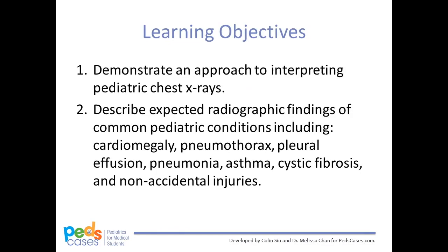The approach explored in this video is a top-to-bottom approach. We will begin by looking at the thymus, followed by the mediastinum, heart, lung fields, diaphragm, and end with the bony structures. The learning objectives are to: 1. Demonstrate an approach to interpreting pediatric chest x-rays, and 2. Describe expected radiographic findings of common pediatric conditions, including cardiomegaly, pneumothorax, pleural effusion, pneumonia, asthma, cystic fibrosis, and non-accidental injuries.